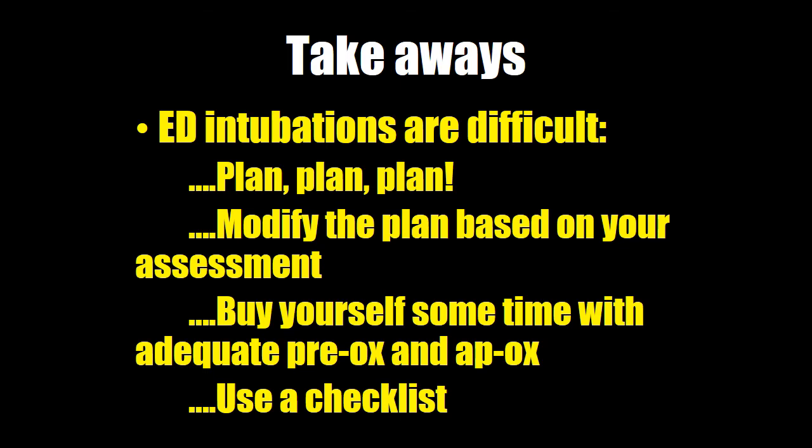If that trolley's there, and you have an airway sim model, so you're doing your laryngoscopy, you've got your tube, and you've got your i-gel or your LMA, whatever choice it is, fast track or i-gel, and you've done your plan A, plan B, plan A, plan B, then the step to D isn't that far, and you might have actually pulled out the kit and looked at it four times rather than never. So it actually moves you down the pathway much quicker.